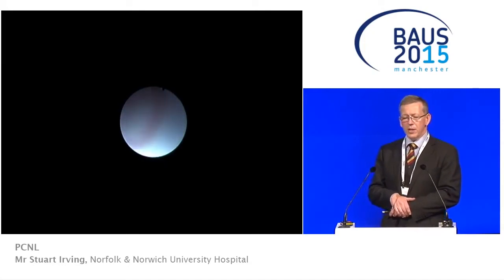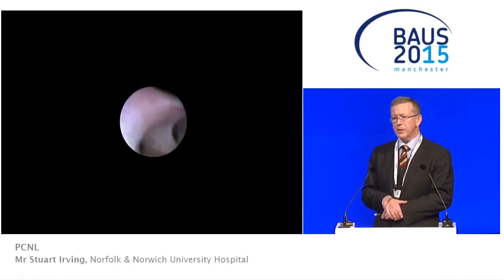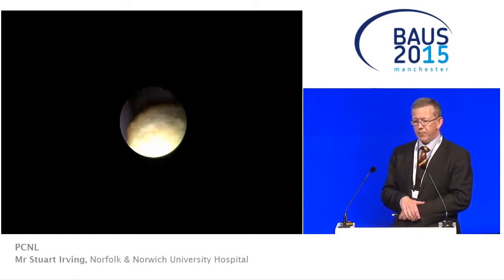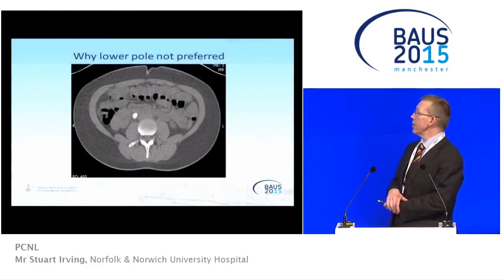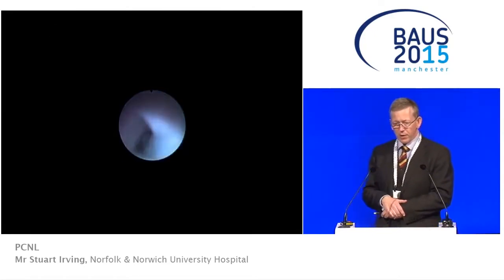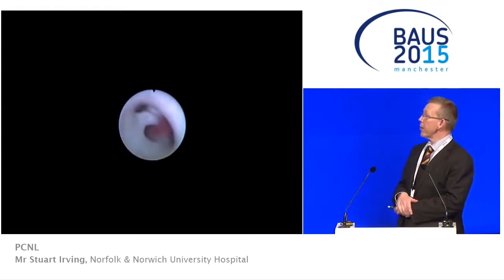We'd already looked at the CT, but after some analysis of the imaging intraoperatively, we elected that the lower pole puncture was probably not the most suitable because of the proximity of bowel gas. This is the CT, and we had a bit of bowel coming around the outside. This is what we elected for, which was a puncture into this calyx here. You can just see we're sort of wiggling the end of the scope, and our radiologists find that very helpful for identifying and being absolutely sure which calyx we're in.